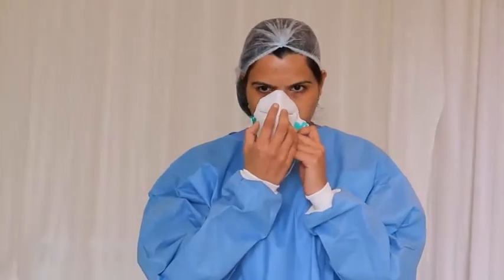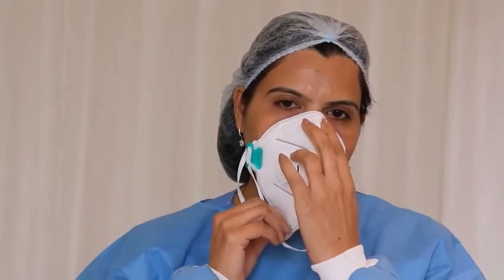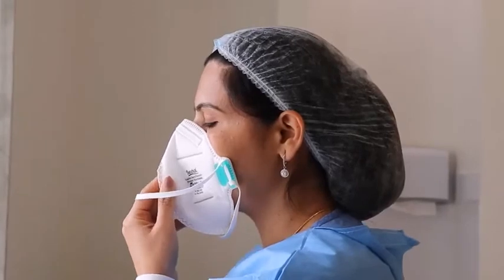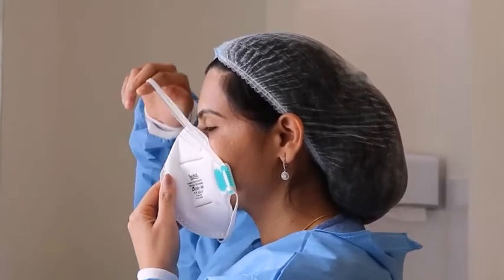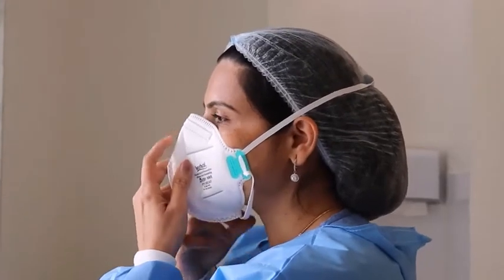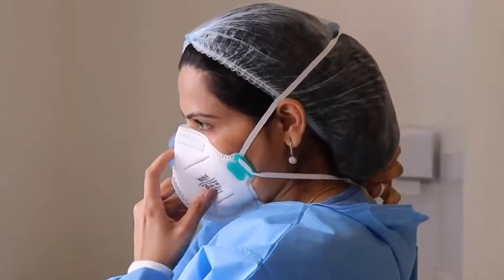To put on the N95 mask, hold the mask in one hand and place it over the nose and mouth. The upper part should rest on the nasal bridge and the lower part should be below the chin. Hold the mask with one hand while the upper strap goes above the ear and the lower strap goes below the ear.